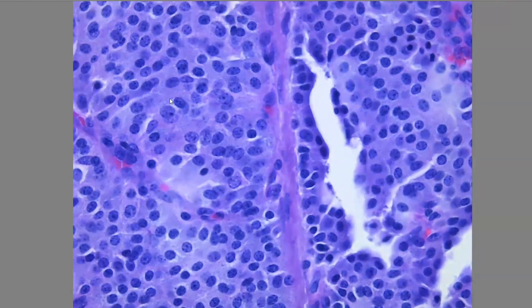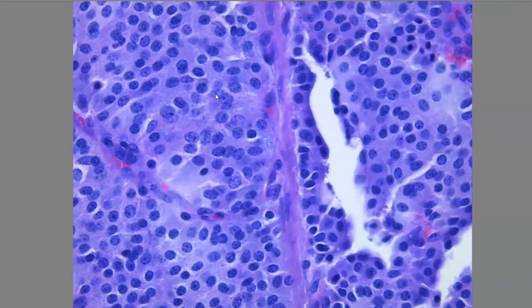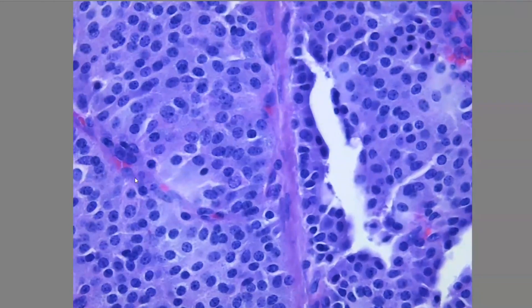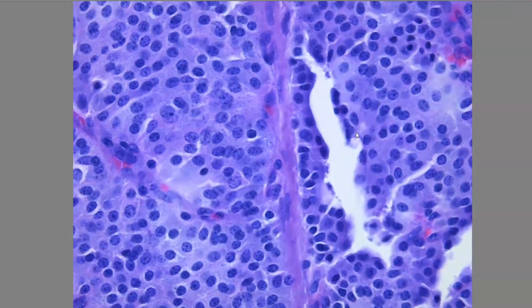At 40x, you can feel that the cells are a bit polygonal or rounded. The chromatin here is finely granular — this is the salt and pepper appearance characteristic of neuroendocrine tumors. We can't see distinct nucleoli; it is just the salt and pepper appearance. The cells have well-defined borders, and the nucleus shows a rounded, well-demarcated nuclear membrane with some margination of the chromatin.